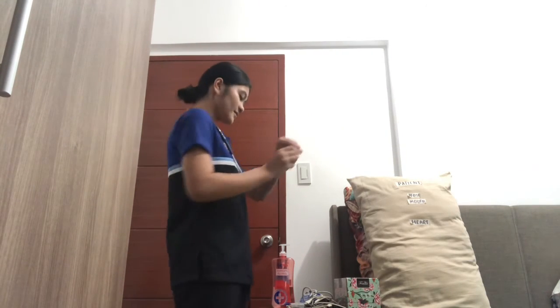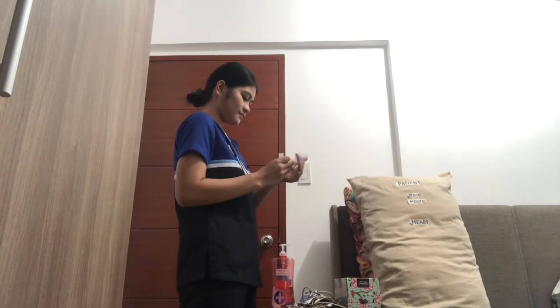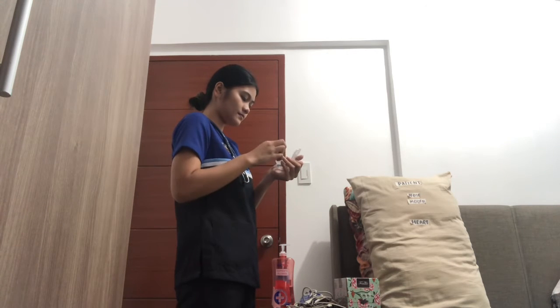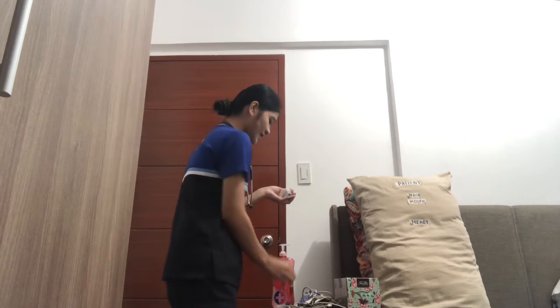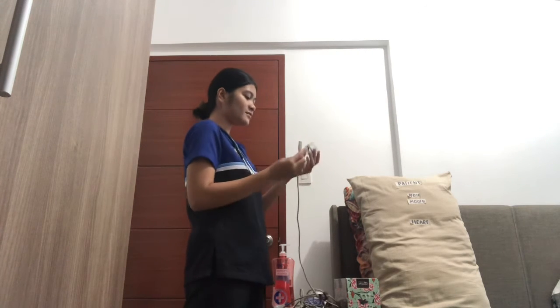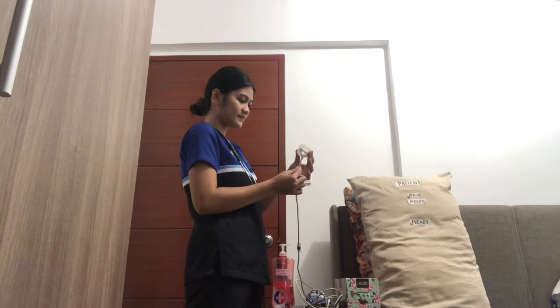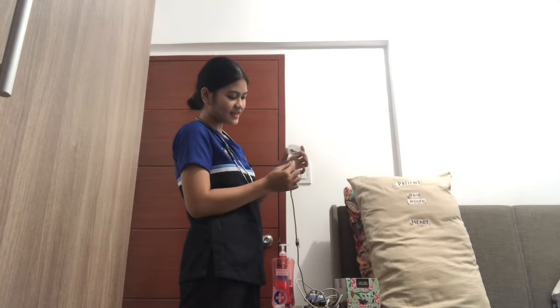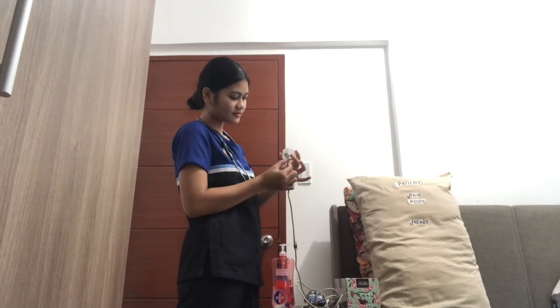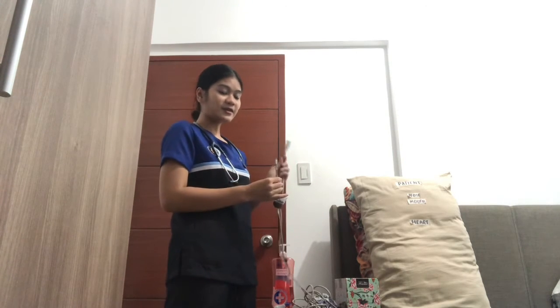So after that, we will now be putting the medication to the chamber. And then after putting the medication to the chamber, we will now get the connecting tubing, connect the end of the tubing to the chamber with the baffle inside. And then the other end of the connecting tubing to the nipple of the compressor.